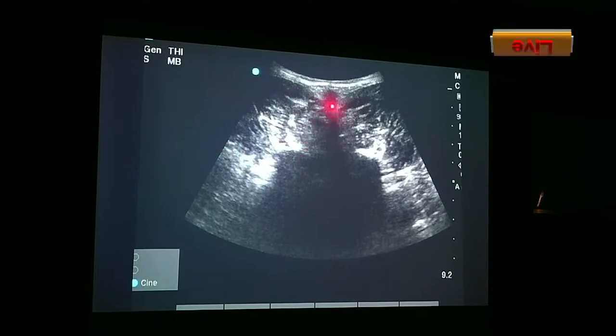So now what is this? This is the IAP, which is very close to the spine. Why spine? Nothing is passing below. If it had left a little, they would have believed it is interspinous. Now you see this thing is very clear. I can see a very nice angle being made. This is the SAP, this is the IAP, this is if you want to go in the joint, this is if you want to go in the medial branch groove.